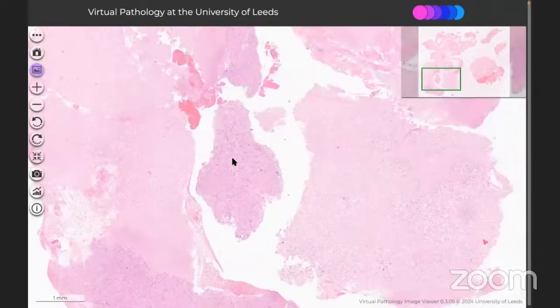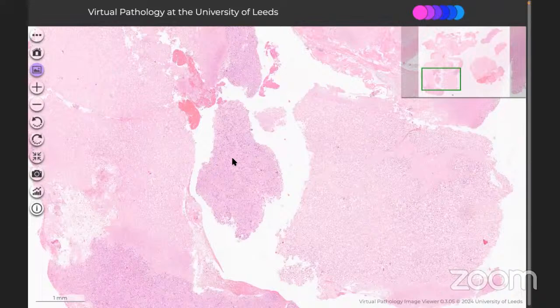And you say that IHC markers I will do to confirm that, that is CK5/6 I expect positive, calretinin I expect positive, and also BAP1 negative as well as MTAP negativity. And if you do a FISH, there is a biallelic deletion of p16.